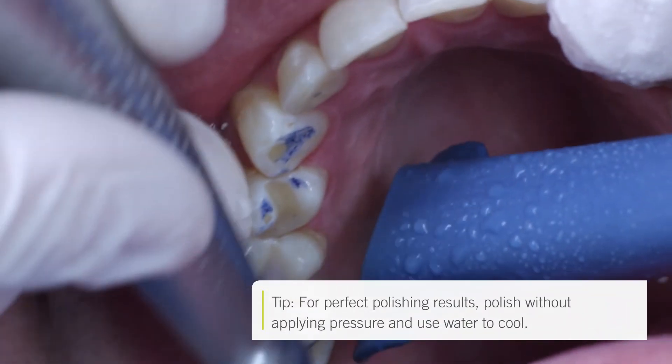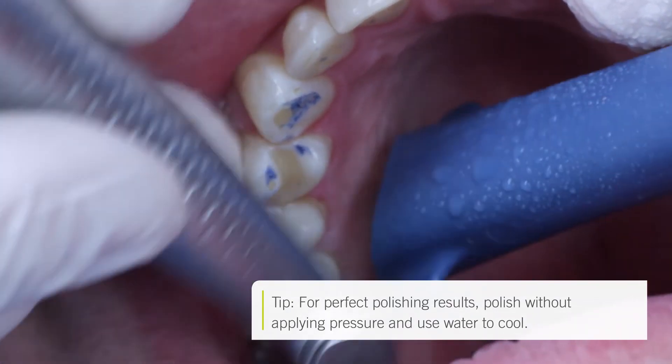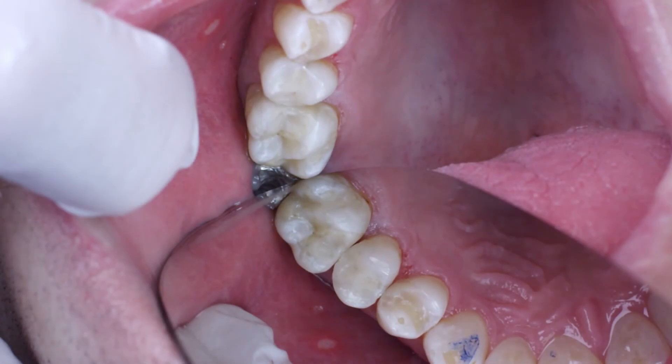Finishing of the occlusal contour was followed by polishing. I prefer to use the Venus Supra system for polishing. This is a two-step polishing system with a pink pre-polisher tool and grey high-gloss polishers.